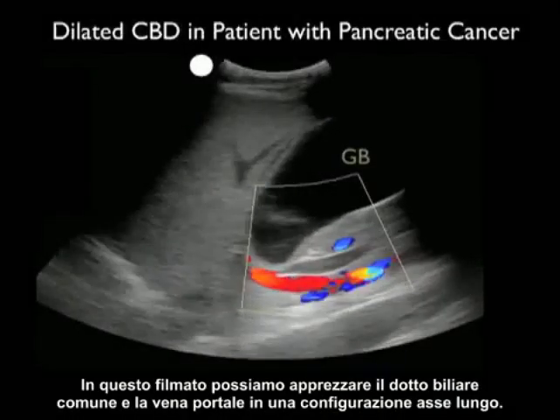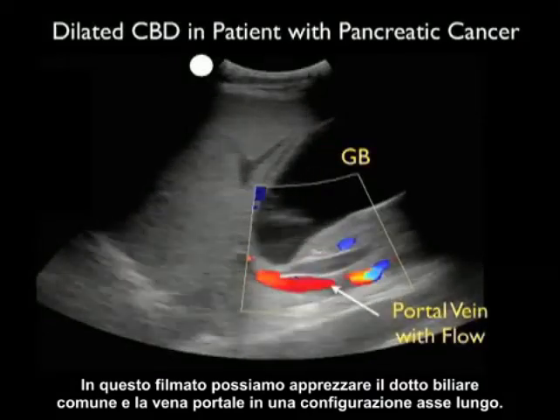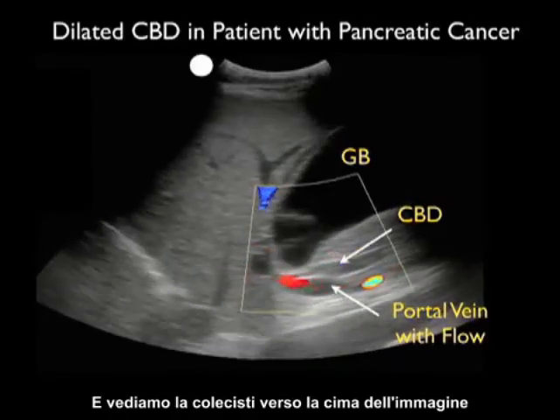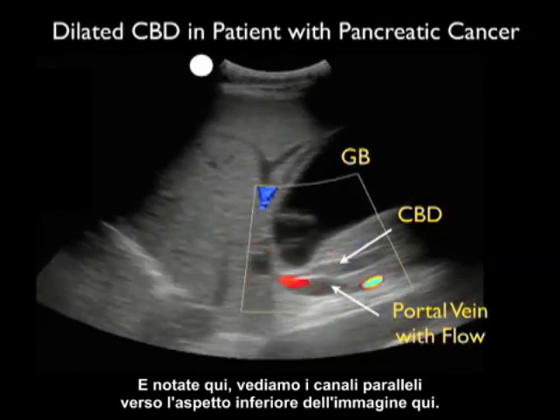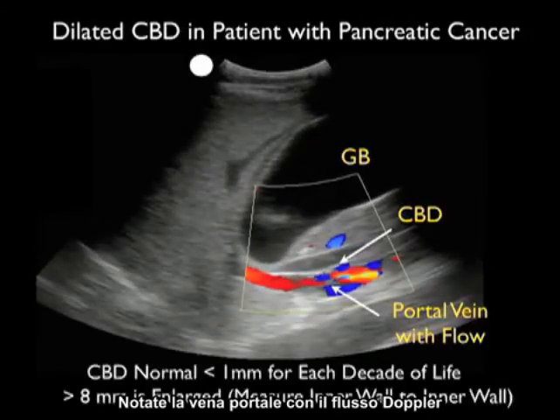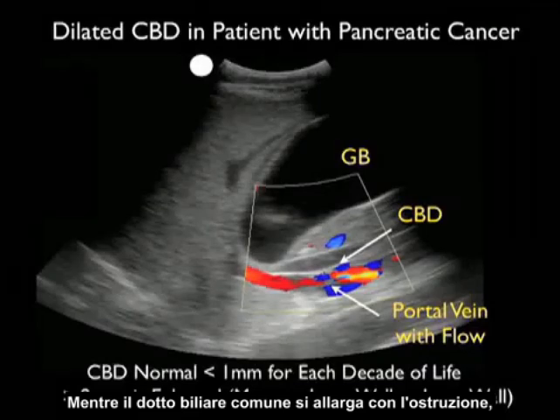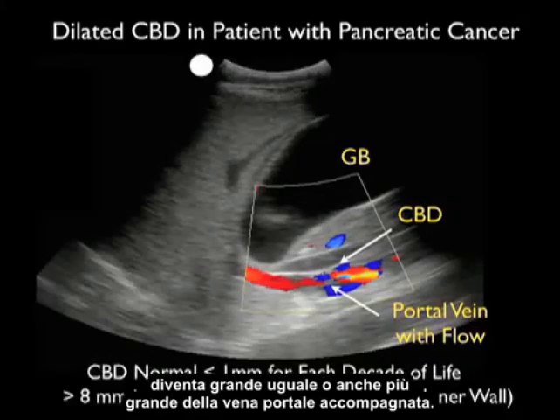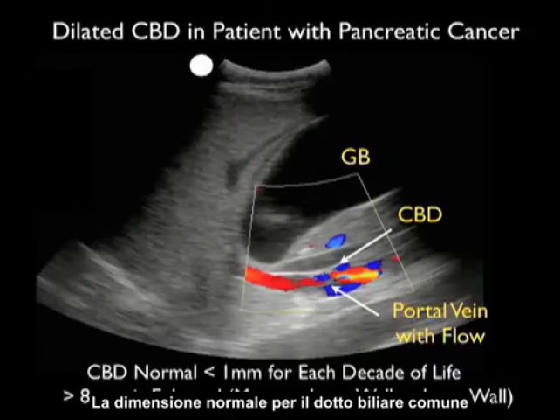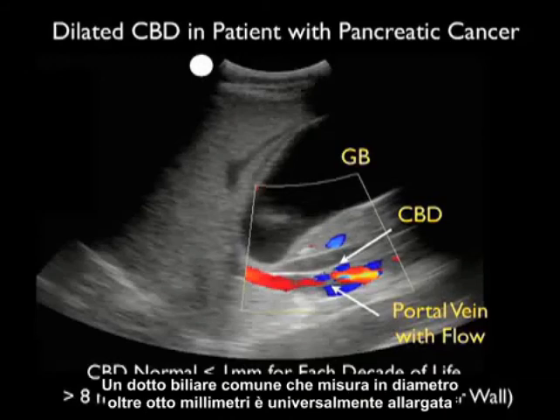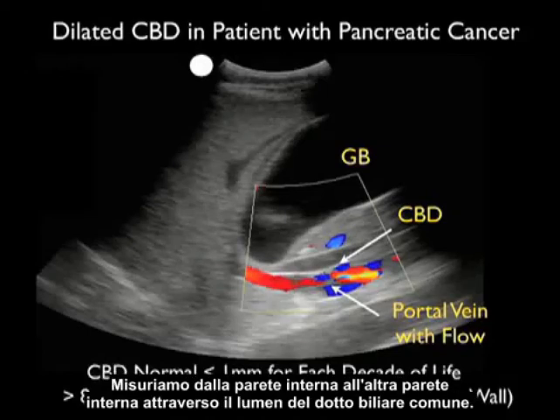In this video clip, we can appreciate the common bile duct and portal vein in more of a long axis configuration. The probe marker is over towards the patient's right shoulder. We see the gallbladder towards the top of the image, and two parallel channels towards the bottom: the portal vein with Doppler flow, and on top of it the common bile duct. As the common bile duct enlarges with obstruction, it will become as large or larger than the accompanying portal vein. Normal dimensions for the common bile duct are no larger than one millimeter per decade of the patient's life, and a diameter greater than eight millimeters is universally enlarged. We measure from inner wall to inner wall across the lumen of the common bile duct.